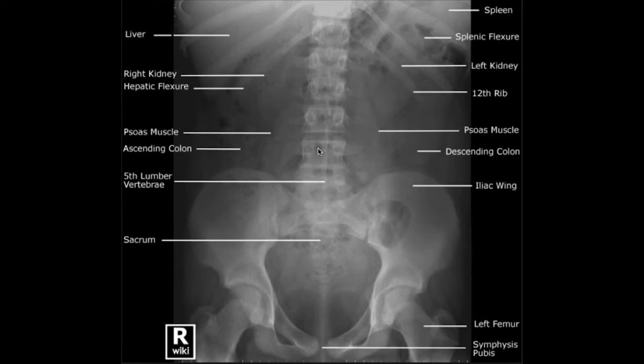This is abdomen x-ray, or in radiology we have another term for it. It's called KUB, kidney ureter bladder, because you can visualize the kidney, the ureters coming down, and then the bladder. It's very sufficient when you want to image the urinary system. Check for a kidney stone, a ureteric stone, or a bladder calculi. Then you can request for a KUB. This is exactly why they call this a KUB, because you can visualize these three structures.